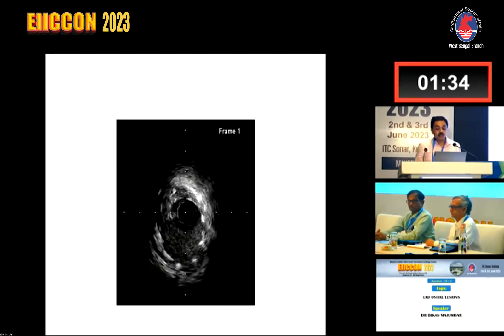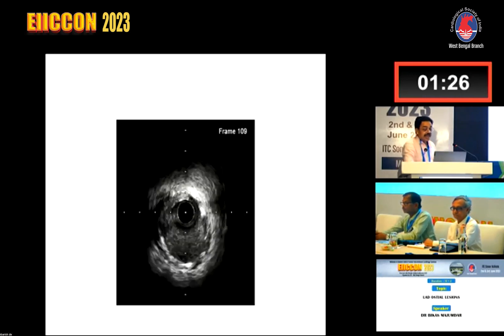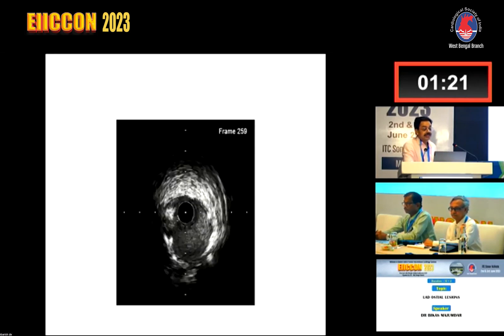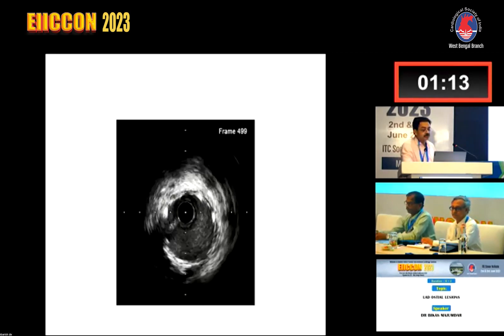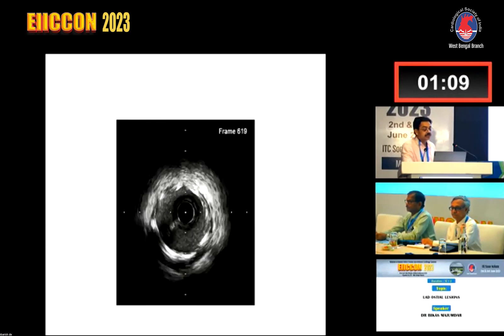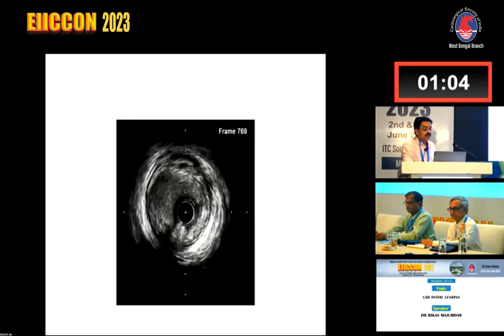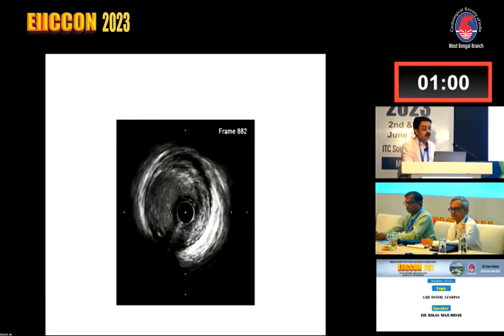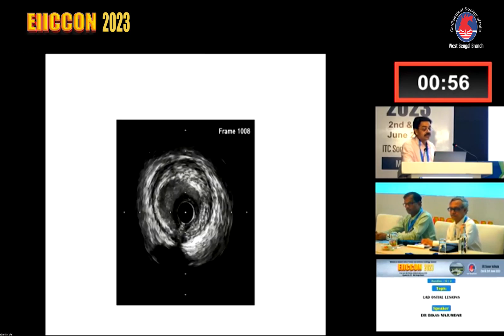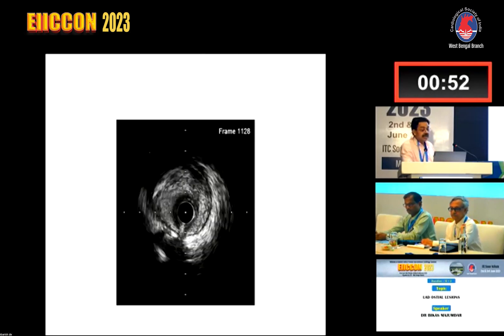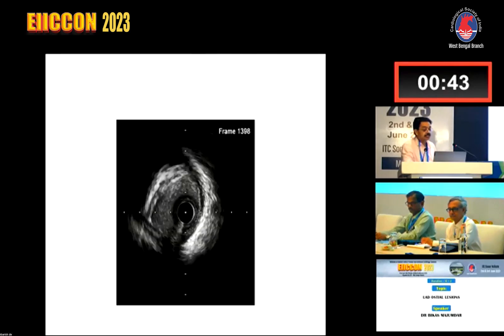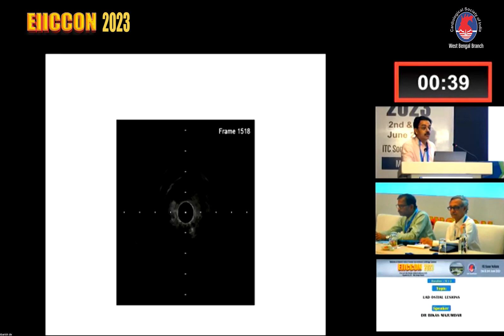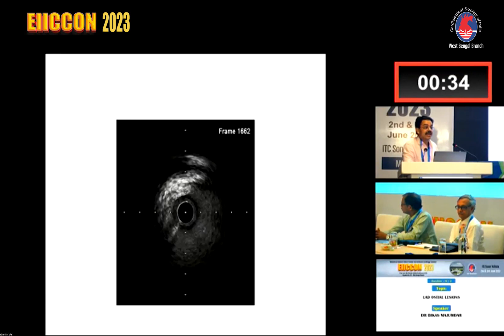In this particular case, I performed an IVUS to assess the area at the osteo-proximal LAD and the size of the left main. Starting from the distal stent placed a few weeks ago after the infarct, you can see that proximal to the stent edge there is significant disease in the osteo-proximal LAD. The plaque is pretty tight. Coming near the bifurcation at the circumflex ostium and into the left main, you can see in the 9 o'clock to 12 o'clock position there is plaque in the left main as well.